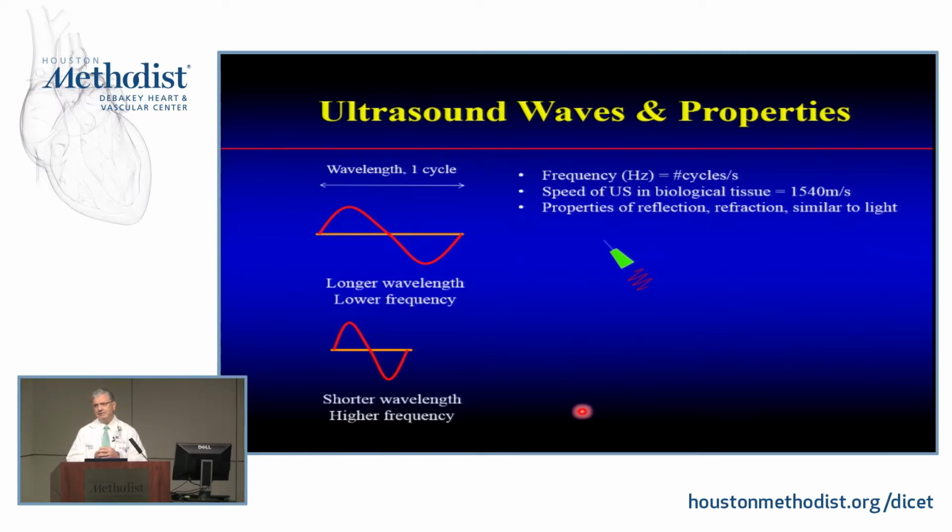And nowadays, it's not excited anymore mechanically. In the early days, you excited mechanically, now it's excited electronically, and very nicely synchronized. But basically, these crystals are responsive to electricity. So you excite it a little bit, it emits a certain frequency, and that's how you initiate this ultrasound that you send.